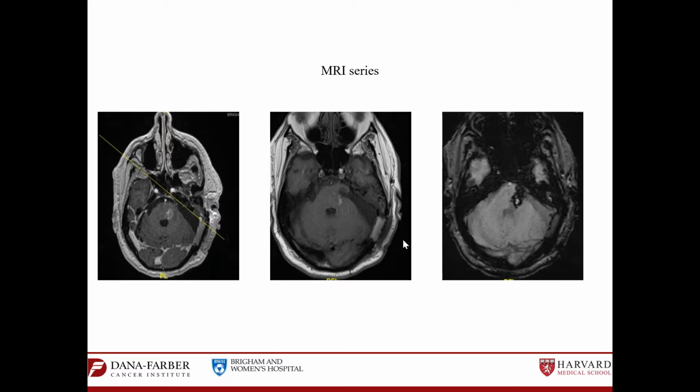So that's a patient who had surgery for a brain metastasis. He underwent craniotomy for metastasis, and that's the surgical cavity here, and it is pushing a little bit on the midbrain. When you look at the first image on the left, it shows T1 post-contrast with enhancement, right? Can you see that enhancement? Can you see my pointer?